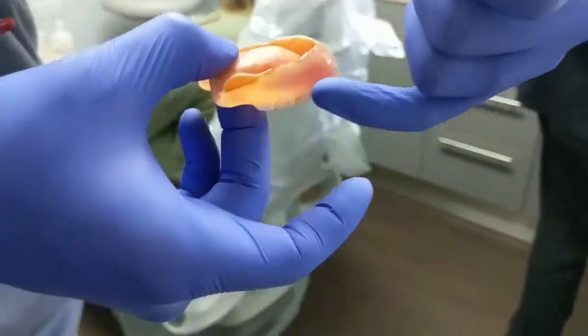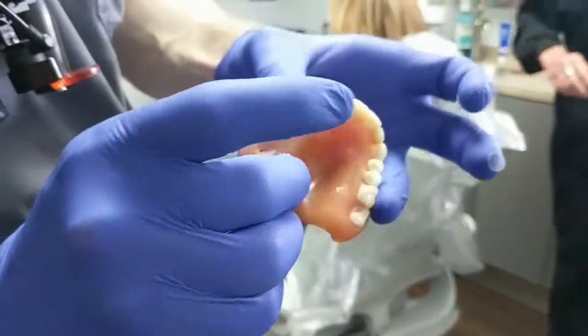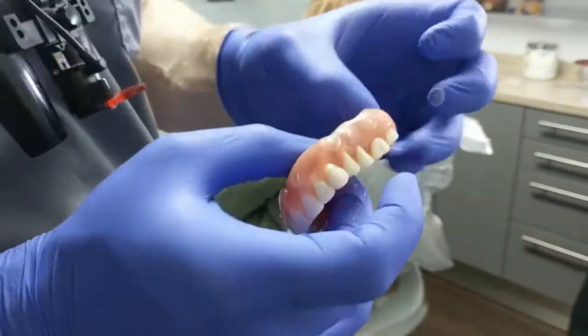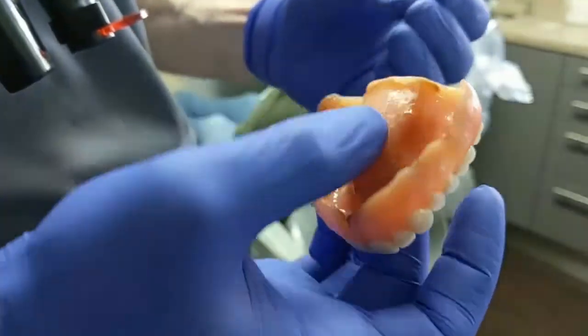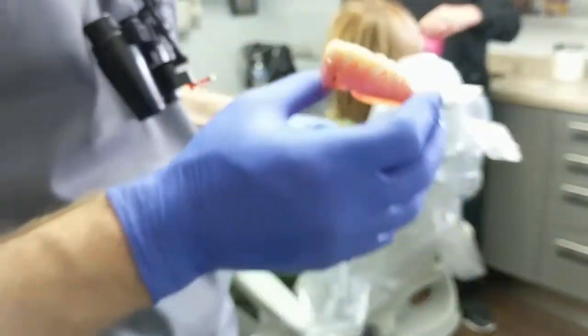We've got stickers here with beads — three on the inside, four on the outside. That should be more than enough. As you notice, a couple of these the beads popped off, and I've not actually had a big problem with that, but be aware of it. You don't want to assume that they have beads on if they don't. Three of them came out that way, so we'll take those off at the end.